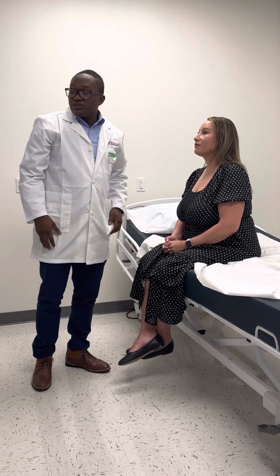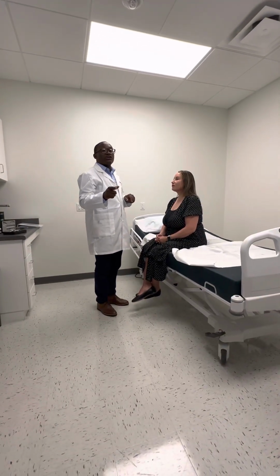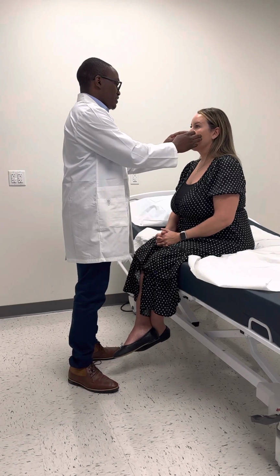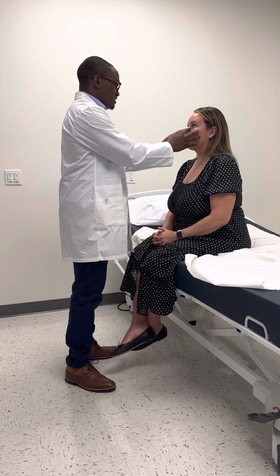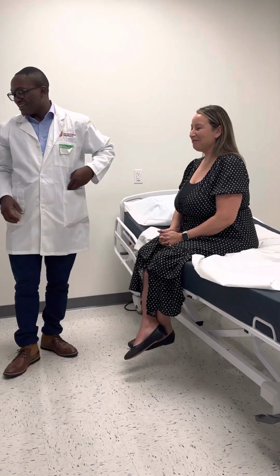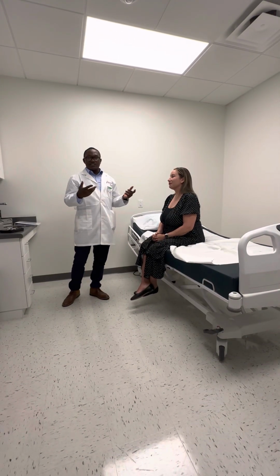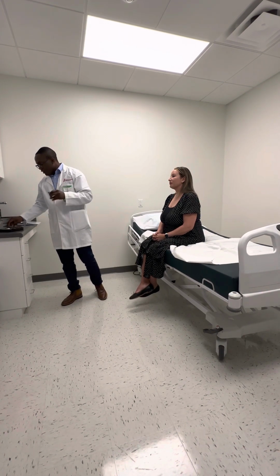So we're going to do the fundoscopic examination. No, before that, we're going to check the lacrimal glands. I'm going to squeeze the medial canthus against the nostril. There's no discharge coming out, so it's normal. Okay. Don't worry about it. So we're going to do the fundoscopic examination. In here, I'm using my ophthalmoscope.